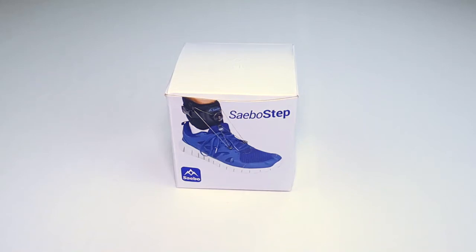I'm excited to talk to you about our popular foot drop product, the SaeboStep. The SaeboStep is an out-of-shoes soft brace designed to help people walk again and not have to rely on a bulky, uncomfortable ankle foot orthosis, or an AFO.